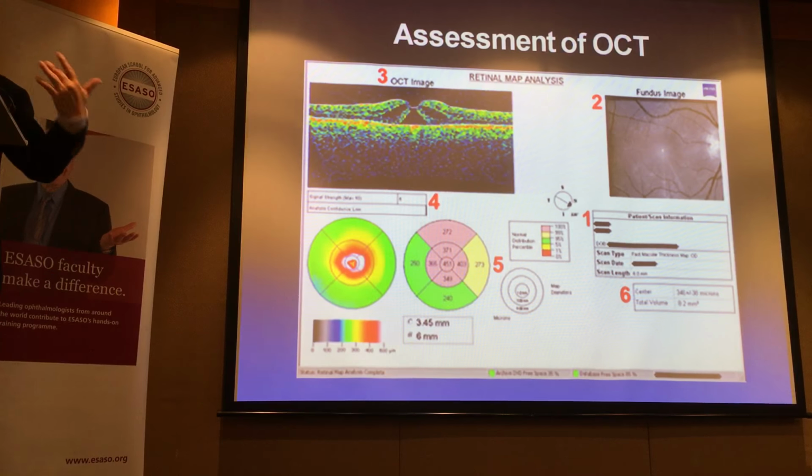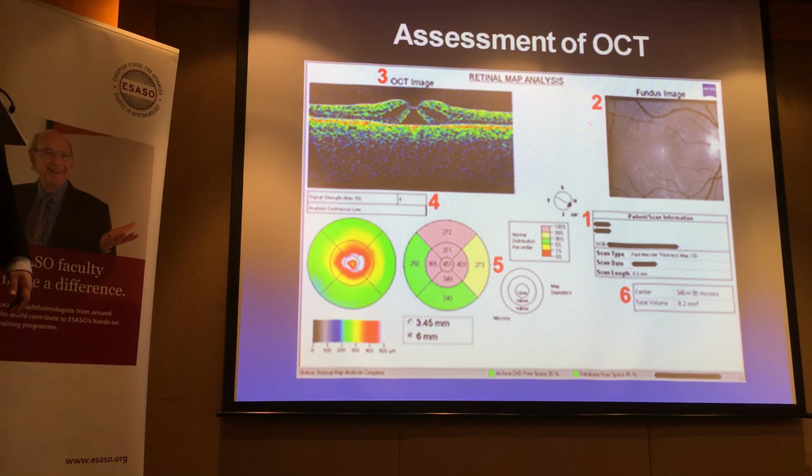Either it's a remote access to the clinic room, or you may need to go to the machine. I know that's difficult, I know that's inconvenient. I still experience that in some cases, but that's what you need to do. One scan may not tell you the whole picture.